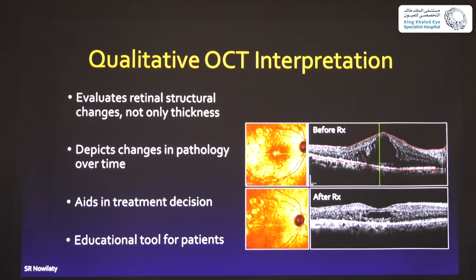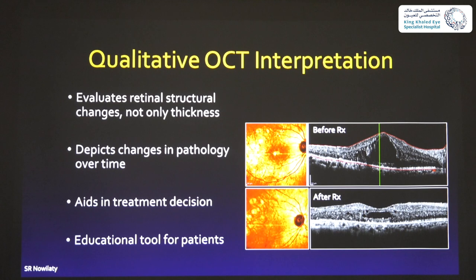We do use quantitative analysis and look at the map, but in the clinical setting we always prefer to look at the structure of the OCT because it gives much more information than just the thickness — it shows what's happening inside. It depicts changes in pathology and changes over time, aids in treatment decisions, and is very helpful for patients when you show them, for example, a macular edema before and after treatment — patients can grasp the concept of getting better when the thickness is decreasing.